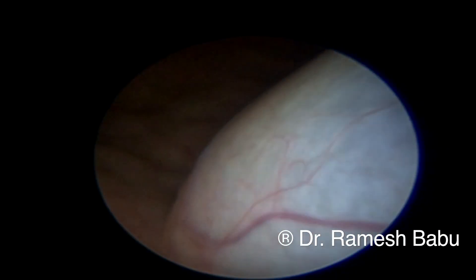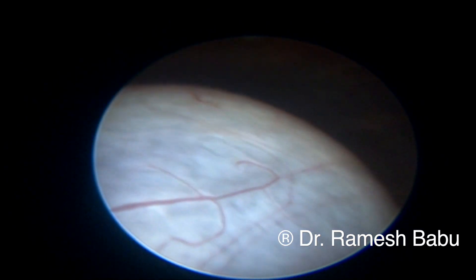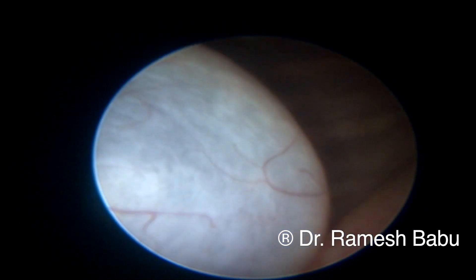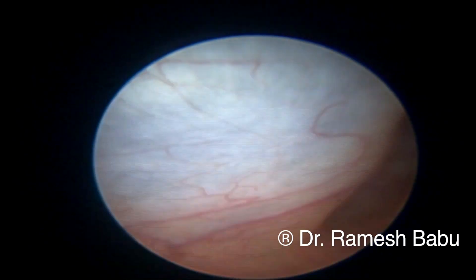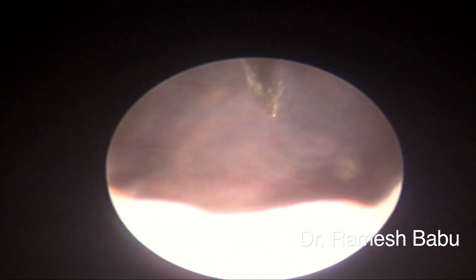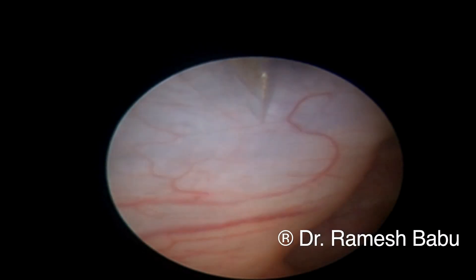Cystoscopically, you could see a nice bulge of the ureterocele on the right side. From this view you cannot see a ureterocele orifice clearly. We decided to perform a puncture with a cold straight knife at the six o'clock position.